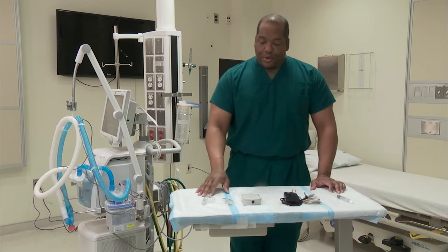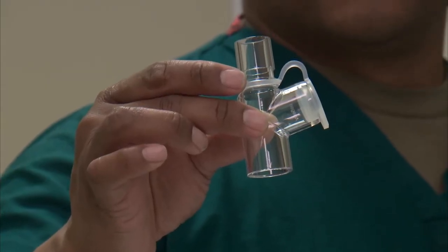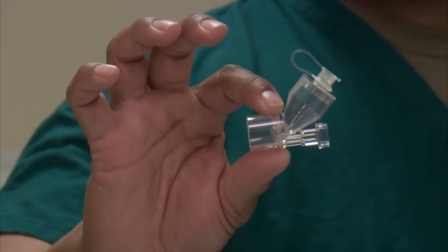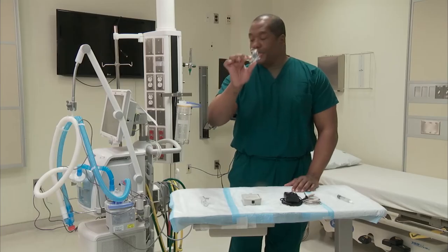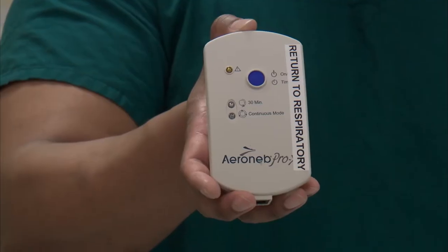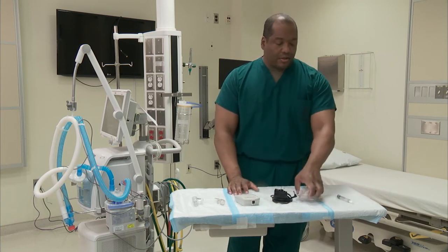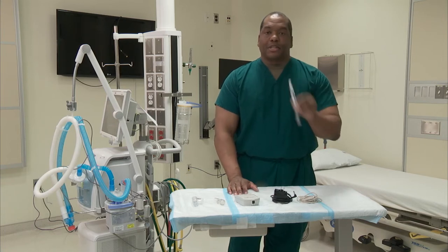There are several components here. The first component would be the T-piece that will be connecting to your ventilator. Your medication container, or your cup — or what we like to call our acorn for obvious reasons — will actually connect into your T-piece. Your control box, power cord, and control wire. And I'm using this syringe as simulation for medication.